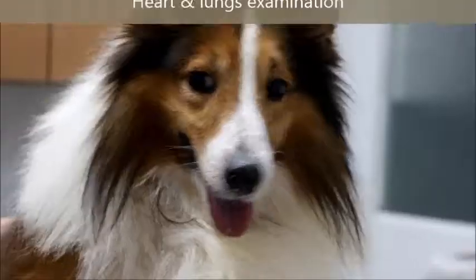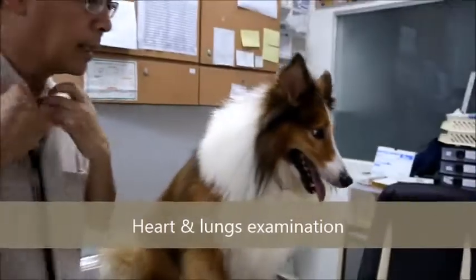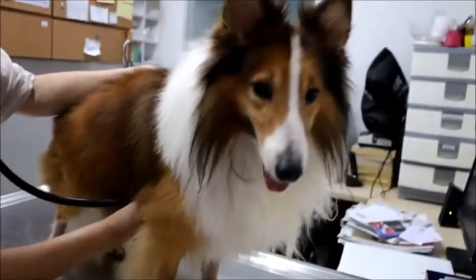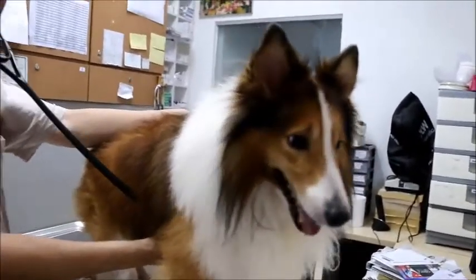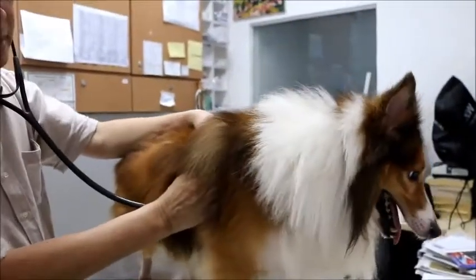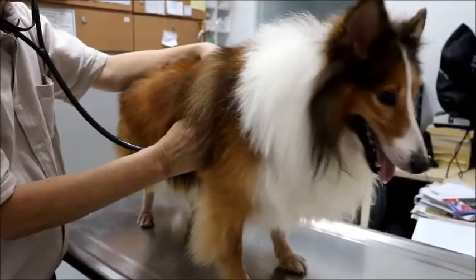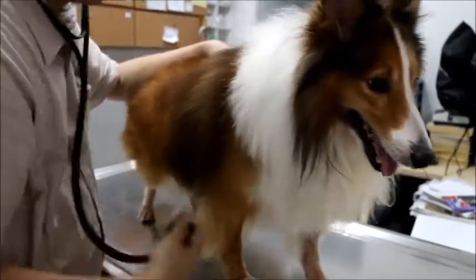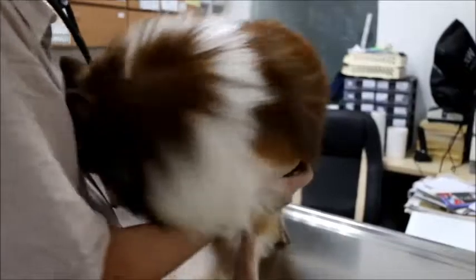But overall the dog is in a normal condition. So now I'm going to check the heart and the lungs. This is a part of physical examination. Check for lung sounds, abnormal lung sounds. The left side and the right side. This side will be the other side.